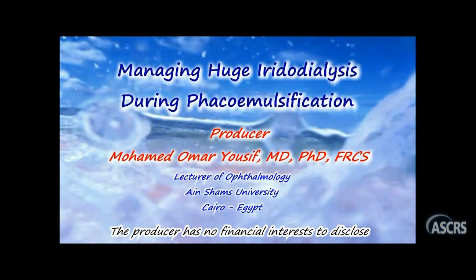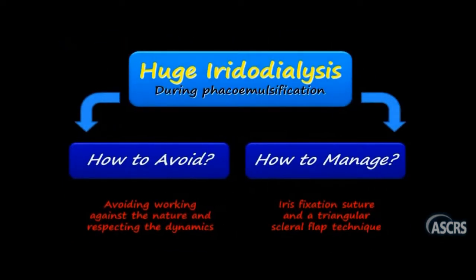The producer has no financial interest in the subject matter of this film. What we are about to see is the management of a drastic complication that may happen during phaco emulsification: huge iridodialysis. We are going to present a case describing how to avoid iridodialysis by avoiding working against nature and respecting the fluidic dynamics, then how to manage huge iridodialysis once it happens by iris fixation suture with triangular scleral flap technique.